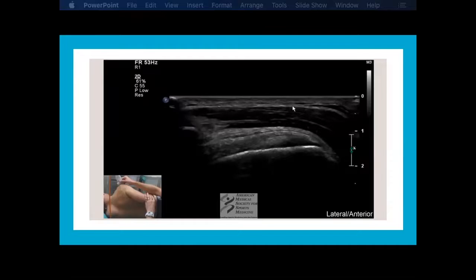And then right below that is the densest of all those things. You've got bone. So it's a very bright line, but nothing underneath that. That tells you it's either bone or a calcium deposit. Next slide.